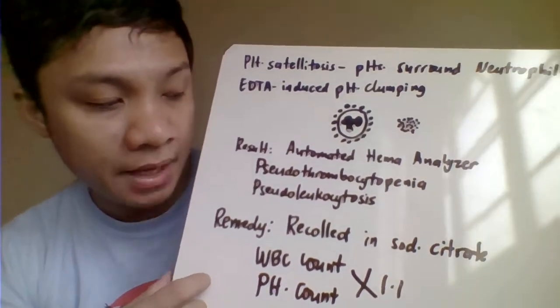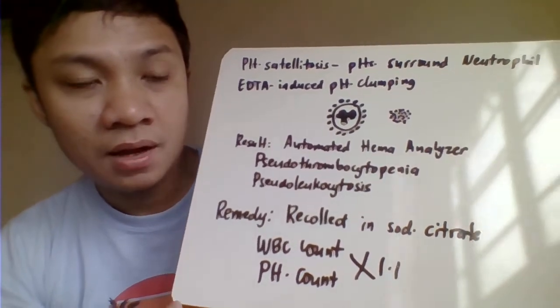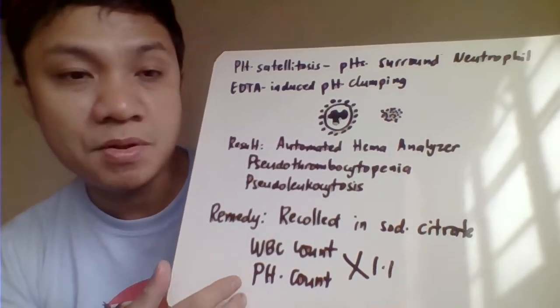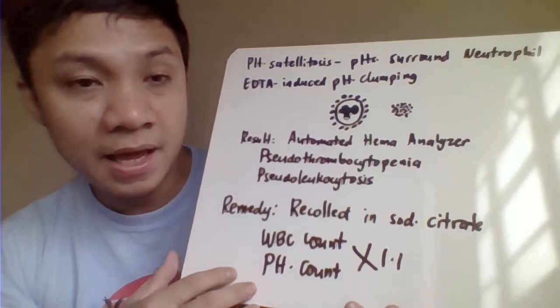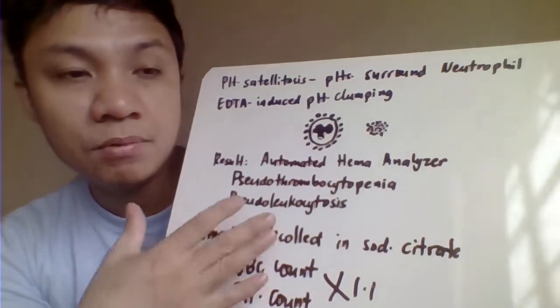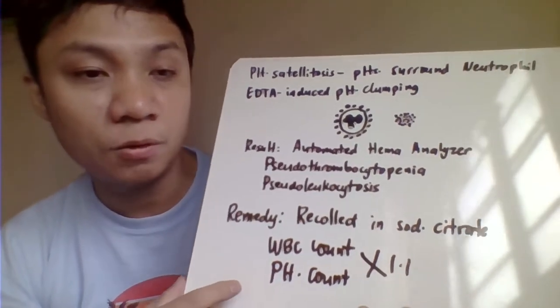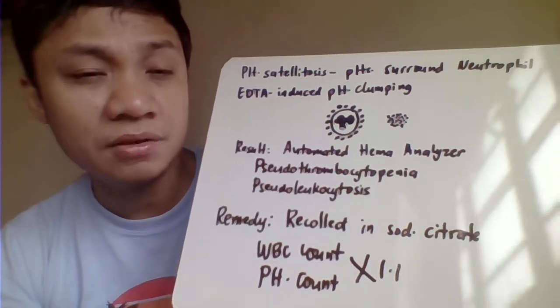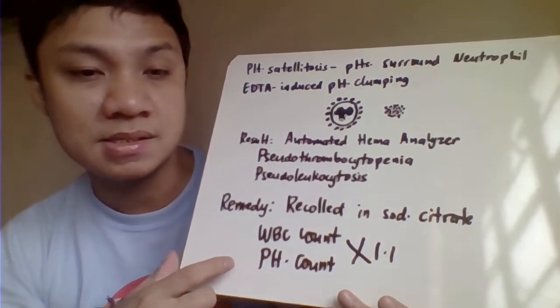and platelet clumping. Or another option here, so when you see that kind of situation, then you need to recollect your blood, but this time you put that one with your sodium citrate instead of the EDTA. And then whatever the result of your machine with your WBC count and platelet count, you need to multiply by 1.1 to have the correction for the clump. To have the correction for your count for both your WBC and your platelets.